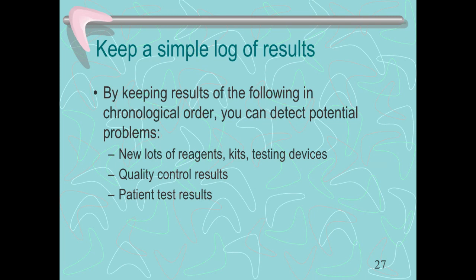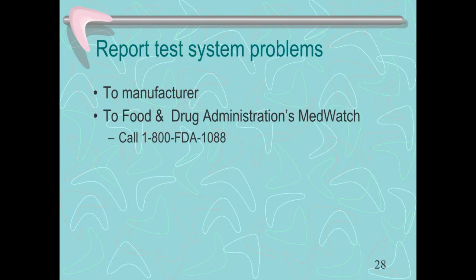So you just have to be sure that you're keeping a log of the test results, a log of your quality control, and then documentation when you change boxes or you change kits or you open a new box of cassettes or testing devices. Be sure that you document that in the control log.